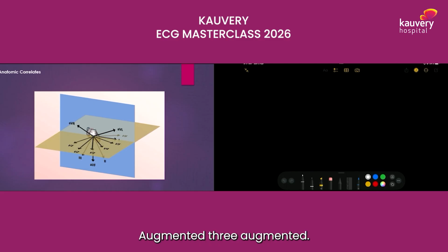3 augmented and 6 unipolar leads. So what are the 6 unipolar leads? Limb leads or chest leads? Louder. Chest leads. Good. So these are the basics. So we are starting with these basics. Yes, go ahead. Yusuf.